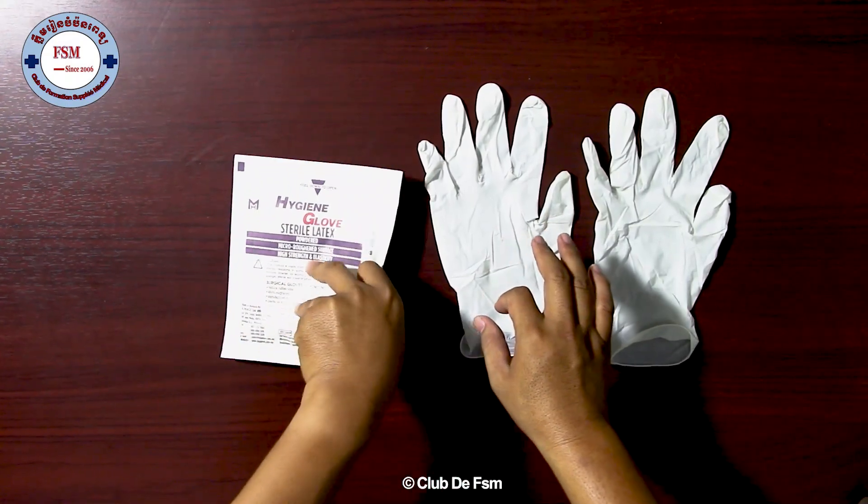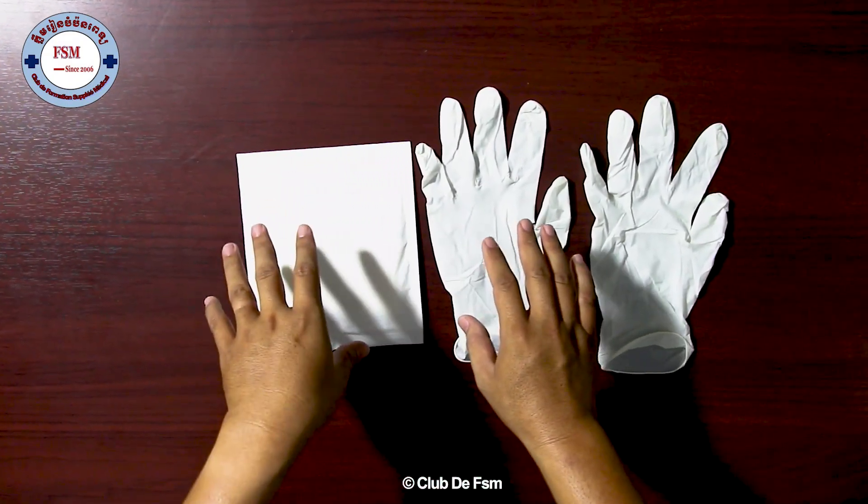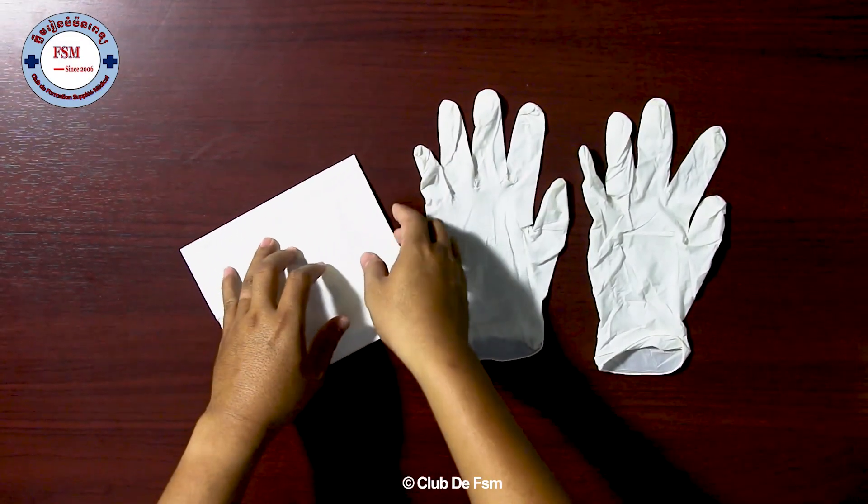Today I will present how to perform surgical gloving. One side is for the assistant. Now we can start.